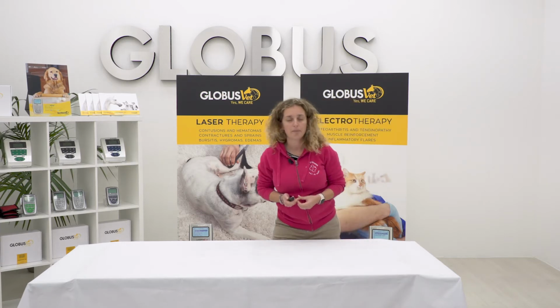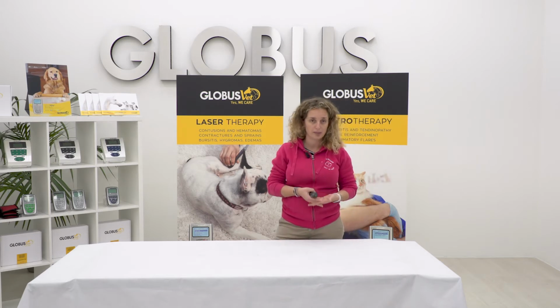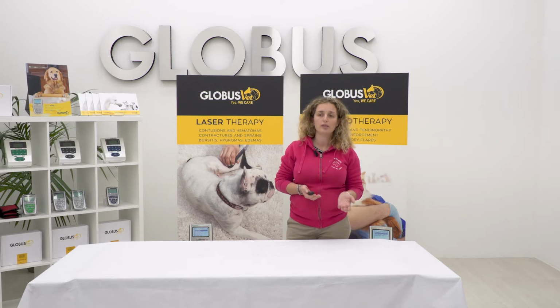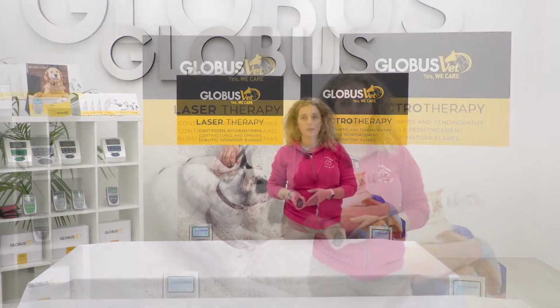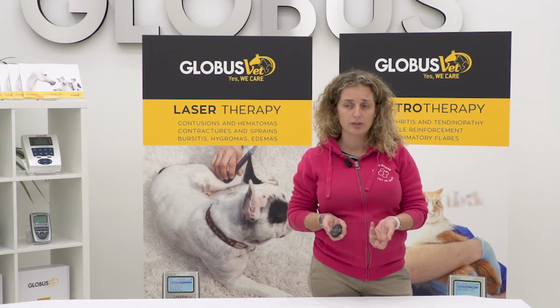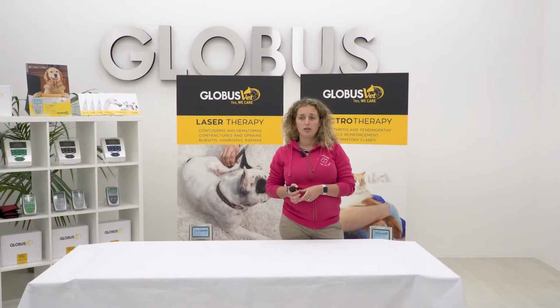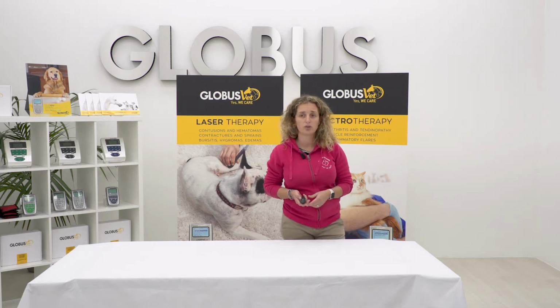But he has elbow dysplasia, with the right going definitely worse than the left, and he has had a fluctuating lameness on the front left limb, so actually the best limb, for a couple of years. Here we can see the X-ray, where subchondral sclerosis is evident, which is a sign of suffering in the elbow joint. On the left elbow we can see a better situation, but nevertheless there is a severe arthrosis of the carpus.